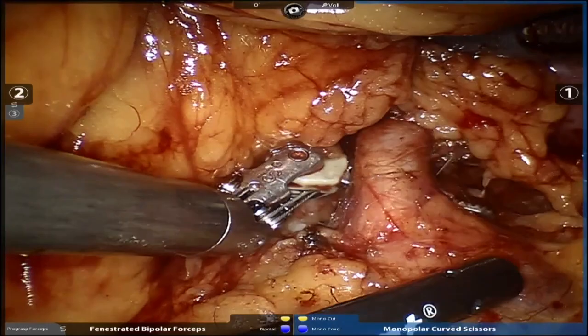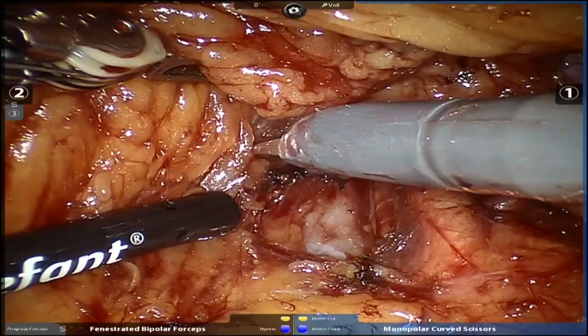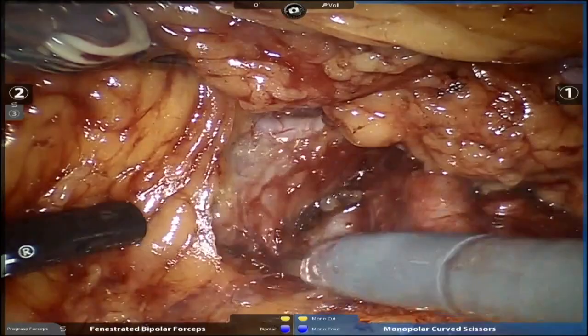But to answer your question, I routinely just get the artery exposed. But in this case, this is a very central tumor. I may do the vein as well. The other reason to do the vein is I think there's another vessel over here, another artery, based on the imaging I have. I'm not able to show you right now, but there's an artery branch up here. You see the artery up there, another one.